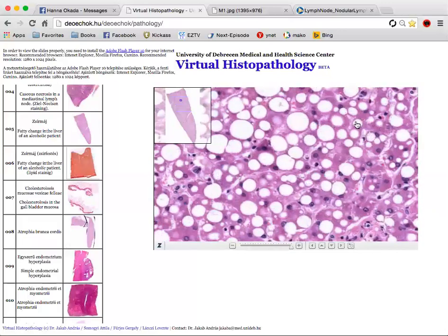Okay. And what happens here is that the hepatocytes are really sensitive, especially in the center of the lobule. And here their metabolism just got deranged.